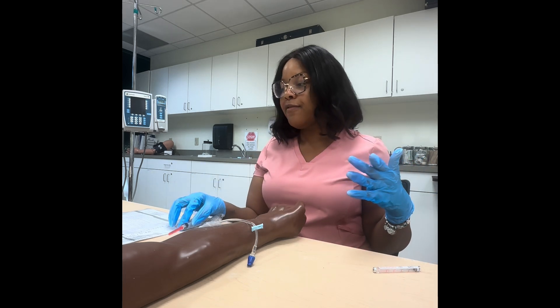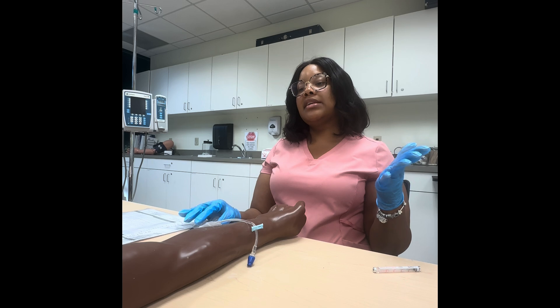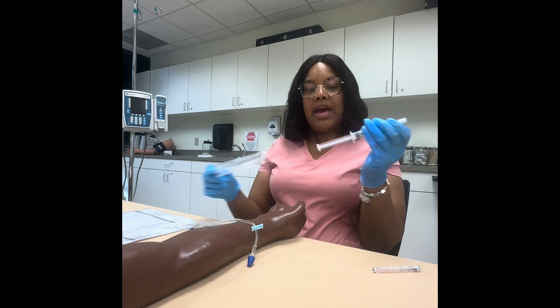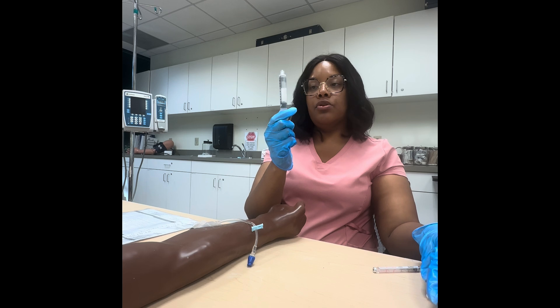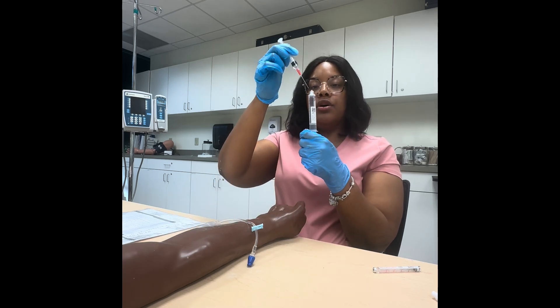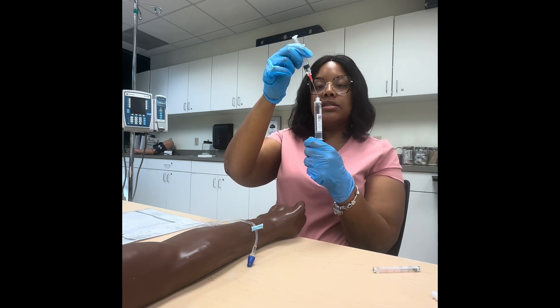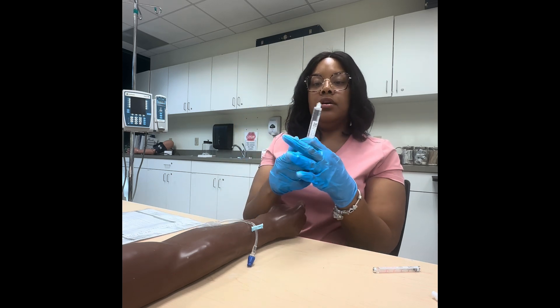Per our facility's policy, the MAR says we have to dilute our morphine with 10 mLs of normal saline and push it over four to five minutes. We have another syringe — pull it back and insert our drawn-up medication into it using the blunt tip needle inside the saline syringe.